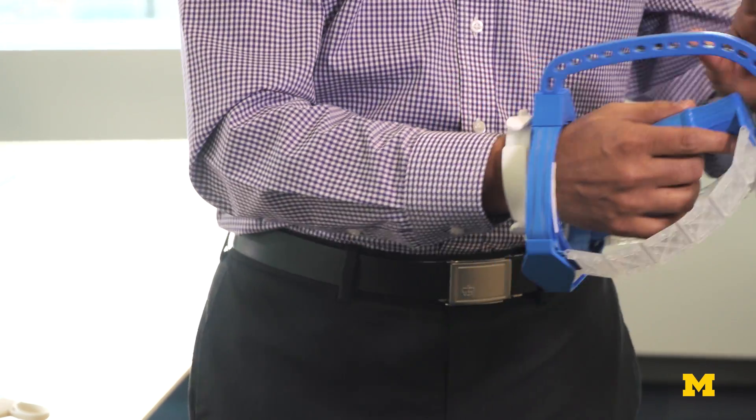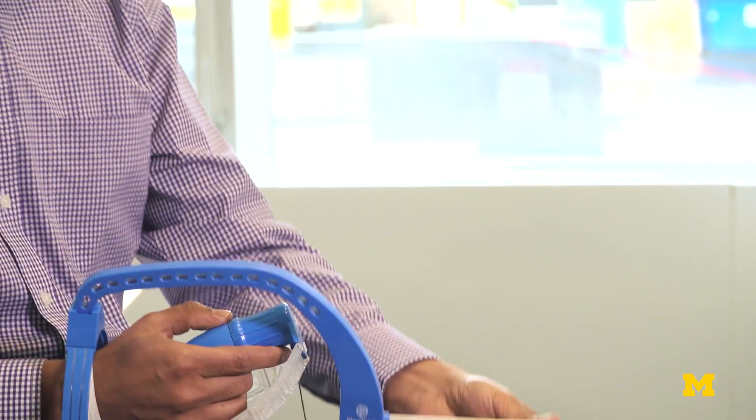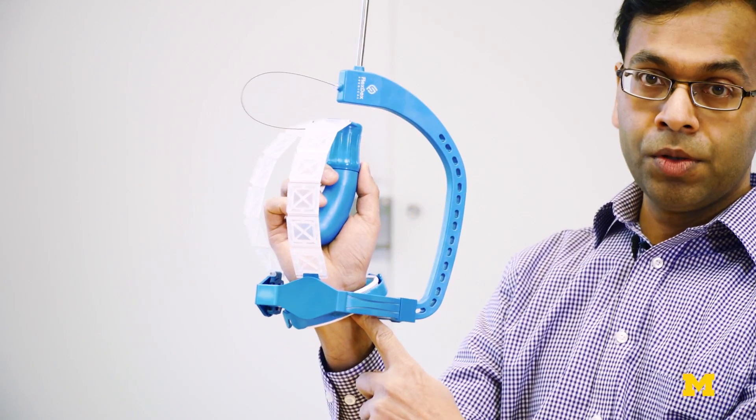In fact, to move the end effector up, I'm actually pointing my wrist down, and similarly to move the end effector towards the right, I'm moving my wrist towards the left. The core innovation in this FlexTex device is a virtual center mechanism that offers a virtual center of rotation for the handle that is co-located with the user's wrist.